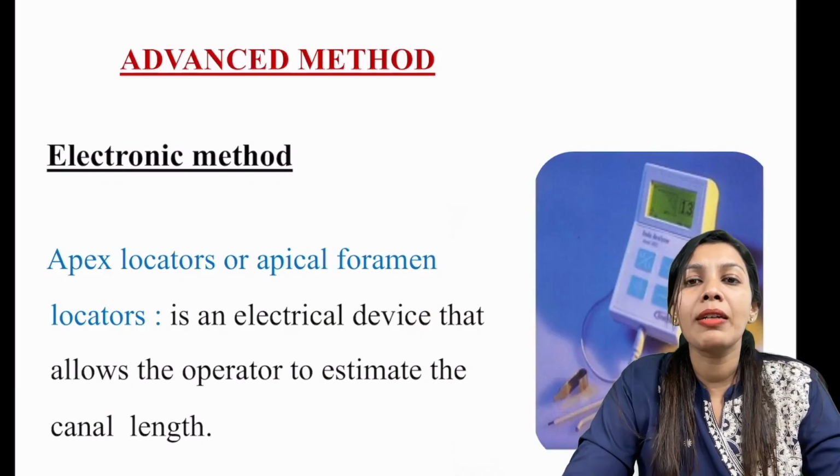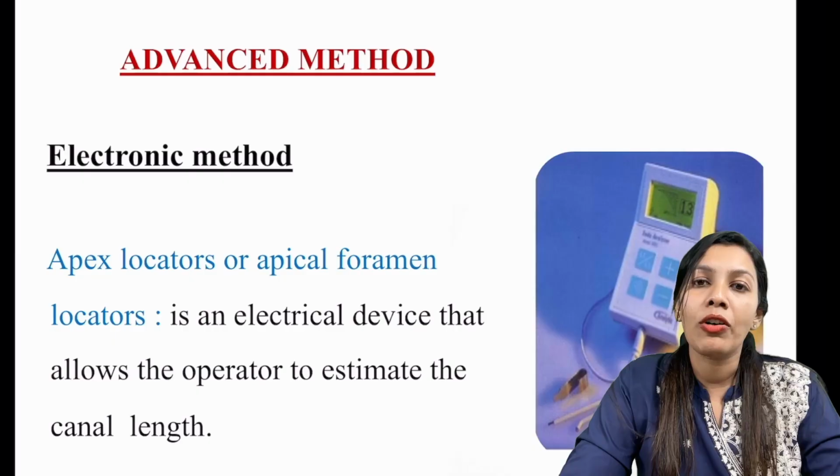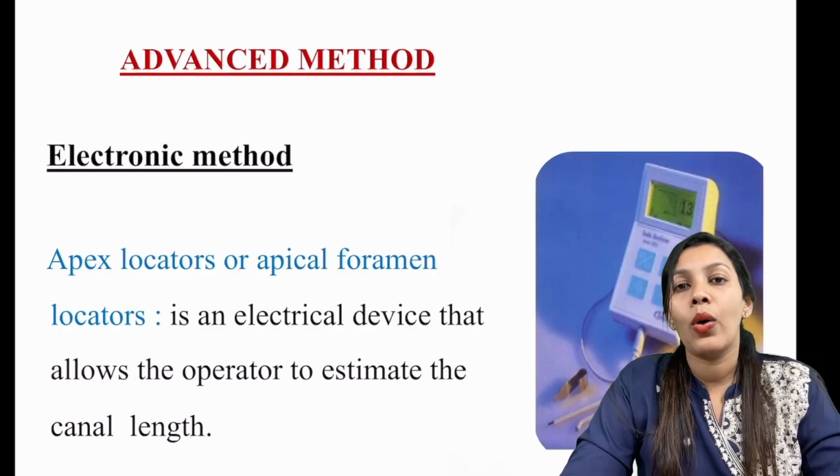Next, very important method. Till now, these were the conventional methods. Next, the most important is the electronic apex locator. It is an advanced method.